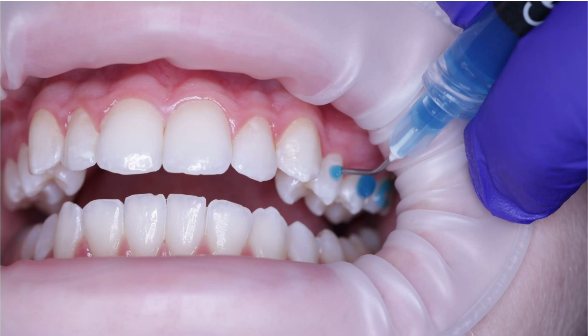So first thing we want to do is go back to the original video that I gave you an overview first. We're going to only acid etch the areas where those attachments are going to be placed. And the reason that you only want to acid etch the areas where they're going to be placed is because when we acid etch the whole tooth, and I can tell you probably 90% of the population acid etch the entire tooth, we end up nitpicking off all the resin in all these areas, and it makes it really tough for us as dental assistants to make sure that everything's nice and clean.